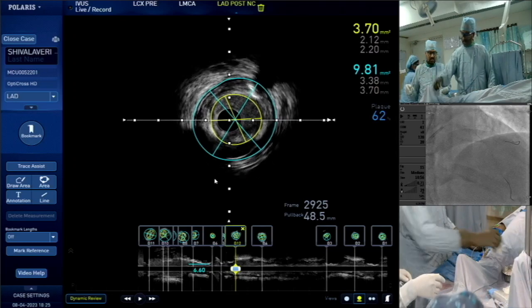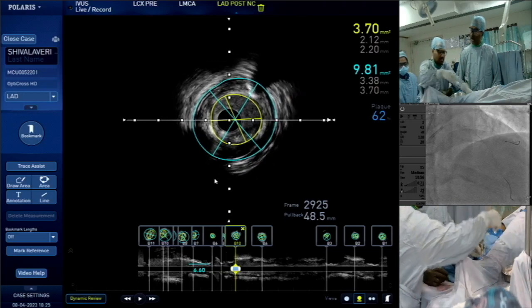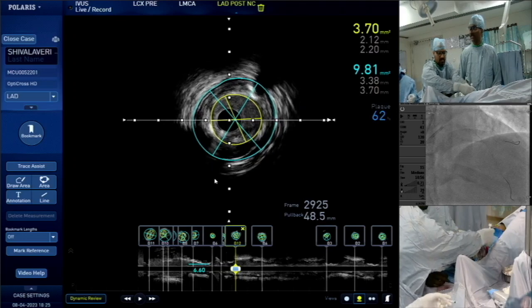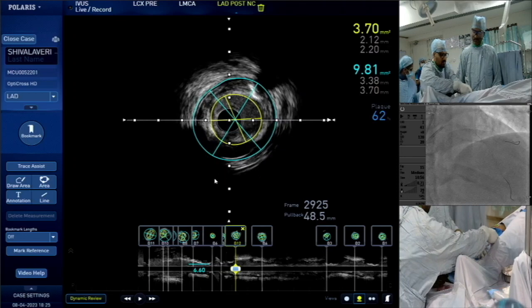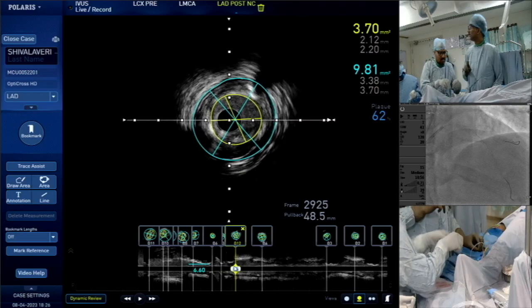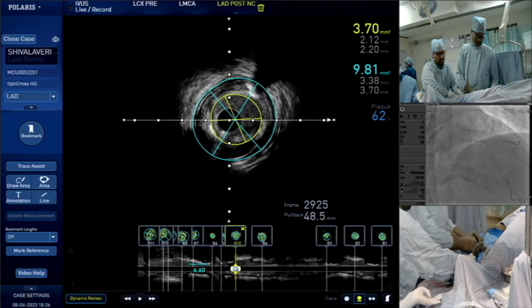Generally with a cutting balloon, I'll take at least 0.5 mm less than the EEM size, okay? So 3 will be my choice here. I'll take a 3 cutting balloon. If you can see EEM in the area of calcium, then it becomes a bit easier. Give me the Flextome, Flextome 3 millimeter. We are going with a 3 cutting balloon, sir.